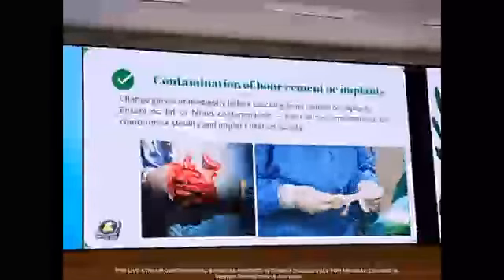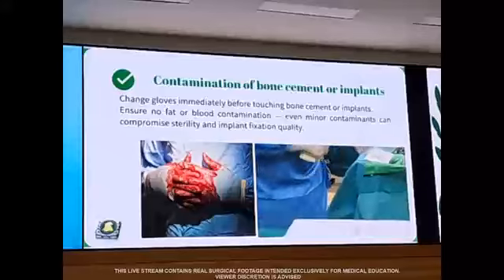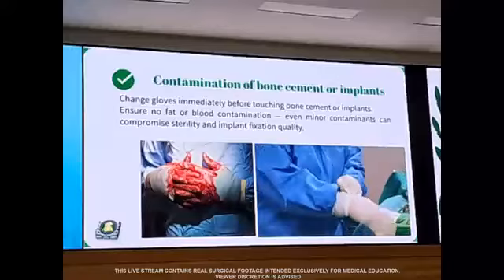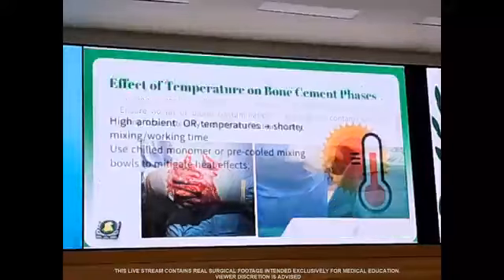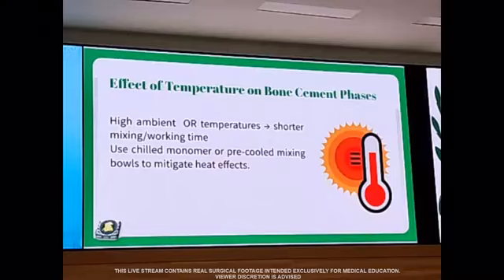Change gloves immediately before touching bone cement or implant. Ensure no fat or blood contamination. Even minor contaminants can compromise sterility and implant fixation quality. With high ambient OR temperature, mixing and working time are shorter. Use a chilled monomer or pre-chilled mixing bowls to mitigate heat effect.